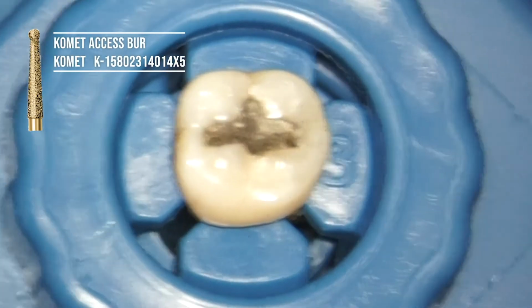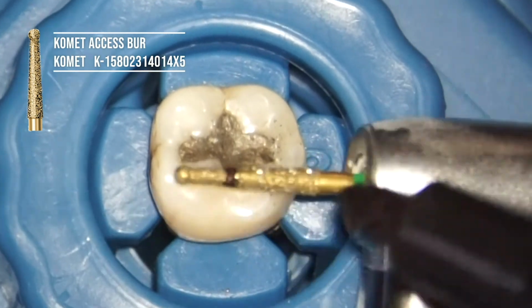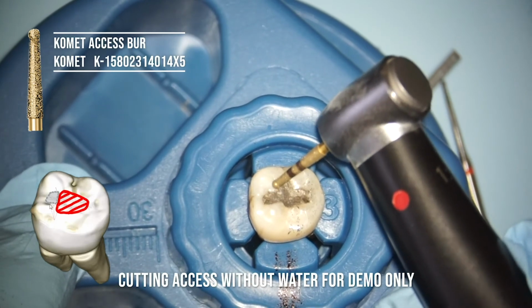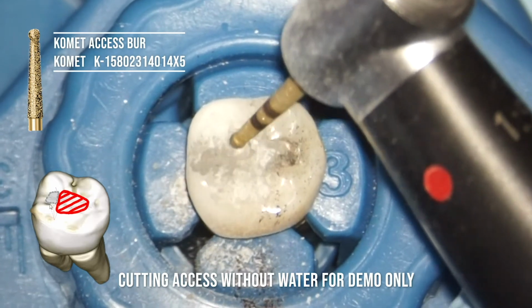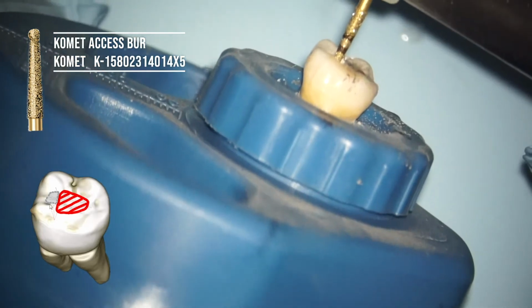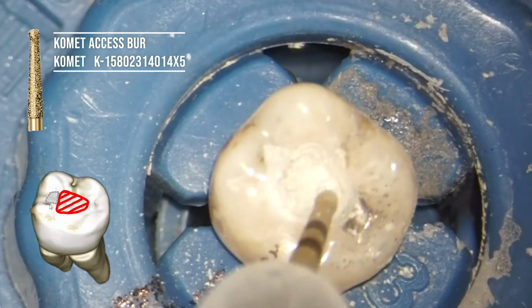This is a really nice burr to start cutting your access cavities from Comet. Actually, Comet have a wonderful range of access burrs. So there's our outline form in the bottom left, just removing that mesial amalgam too. Notice the distal, I should have taken a little bit of distal amalgam out of this prep, which I did not. Removing these amalgams, they've probably got caries or some cracks underneath them.